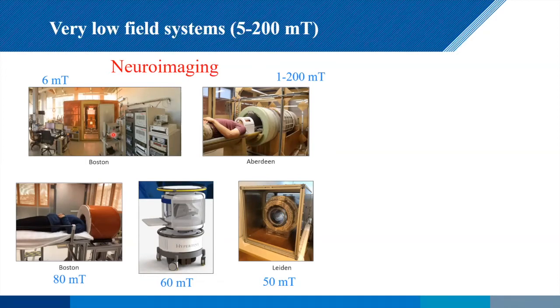So we may make lots of engineering mistakes, but the basic physics is there for us to be able to get signal to noise. And then we look also at Clarissa and Larry's setup over here with the Halbach with the built-in gradient. And again, really nice high signal to noise images coming out of that.